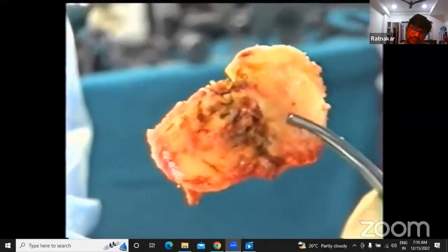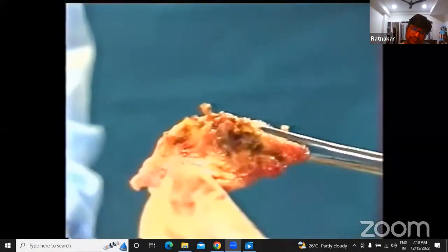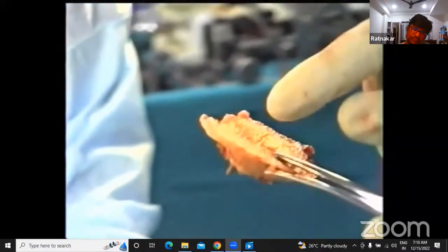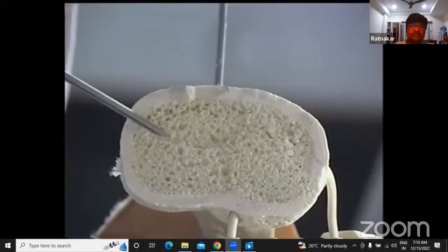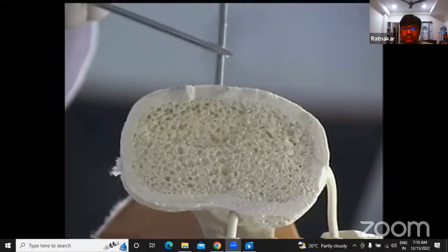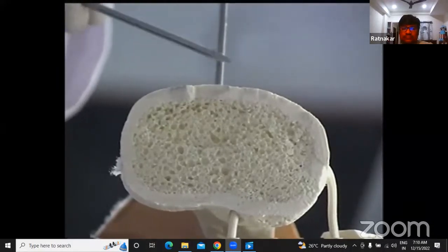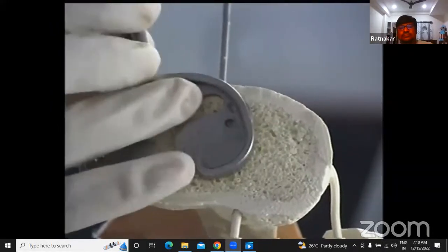That is a properly cut tibial top, and you can see the thickness here. There is an unaffected lateral side, and you can see the thickness, hardly anything here. That is the affected medial side. Now, for your convenience, I'm showing the top of the tibial surface, and that is the anterior part of the tibia. And I put this pin on the medial one third of the tibial tuberosity to see the alignment. And this is going to be a very crucial step for our tibial base plate placement.